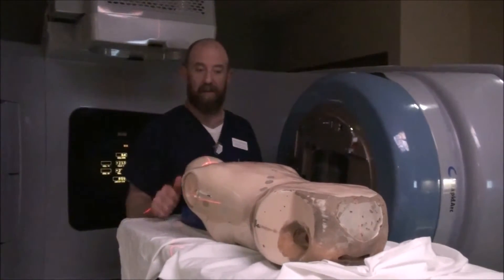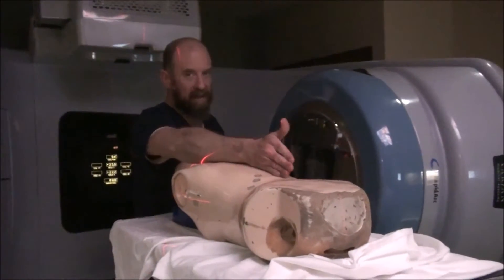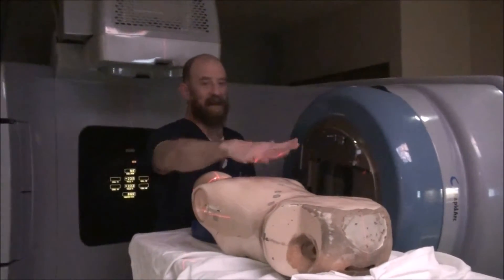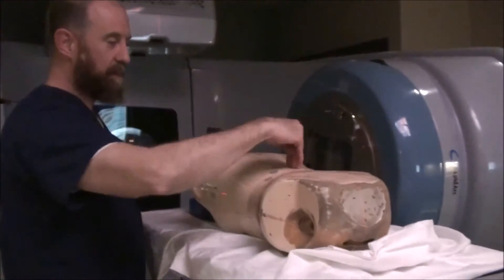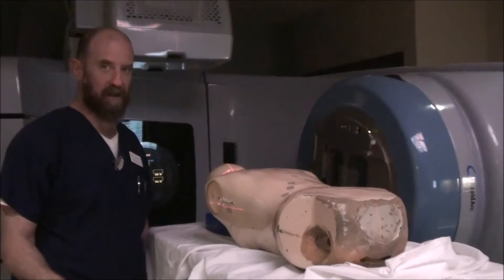If they're overweight, I have actually had to take x-rays to make sure the spine is straight. Because you can palpate and you can line up to marks all you want, but if they've got too much junk in the trunk, it's not going to line up right. You want to be able to line head, neck, spine, butt all in line before you ever start actually lining the patient up.